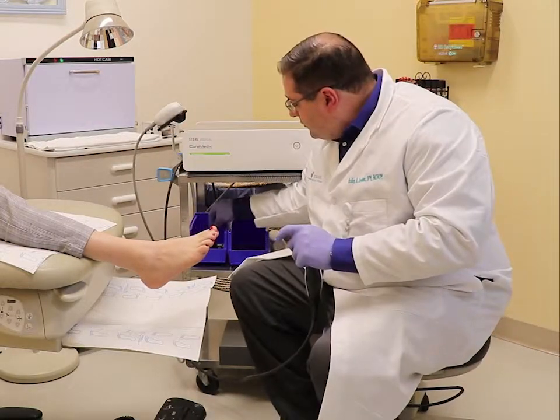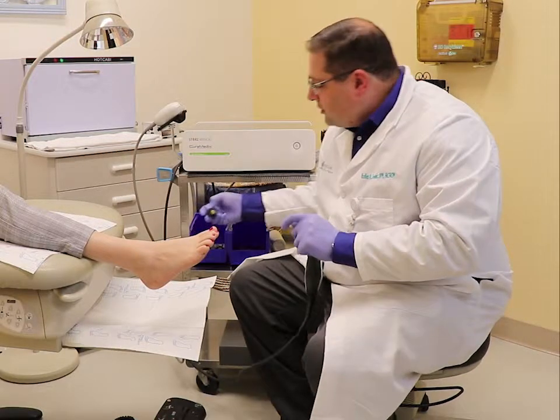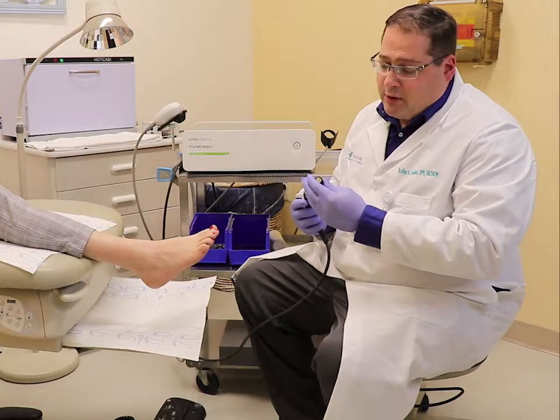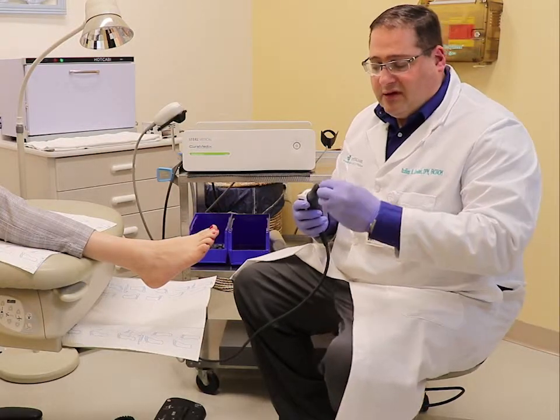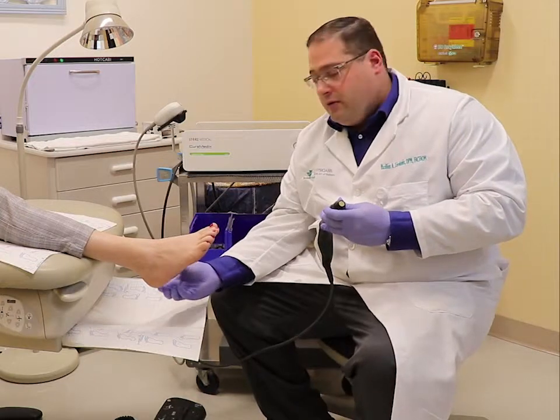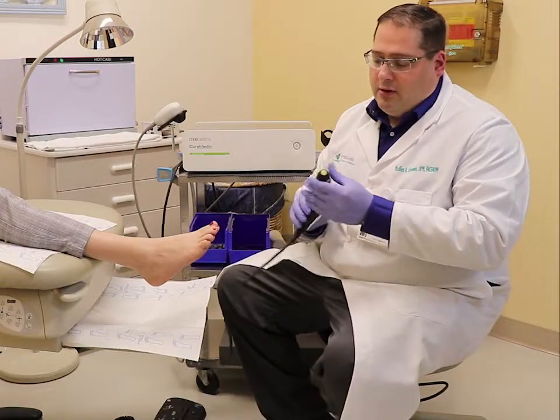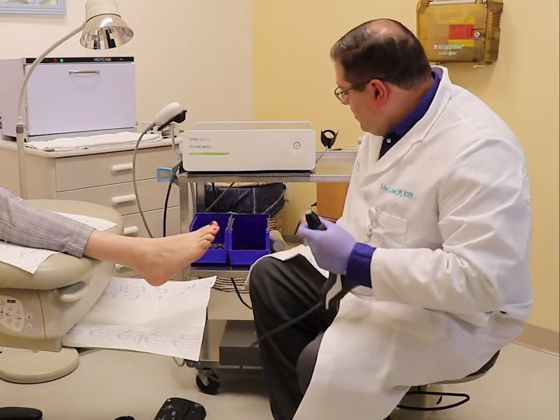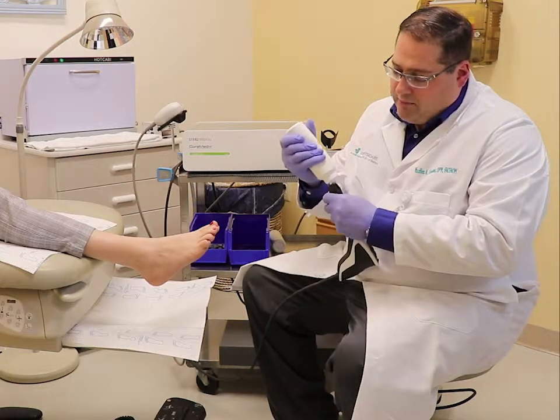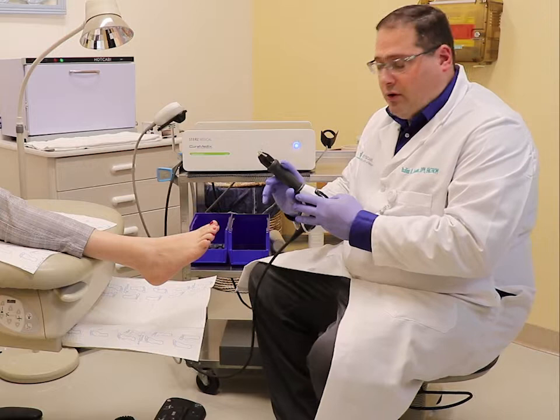The first part of the treatment involves this smaller applicator. This is narrower than the other one and is designed for deep tissue. It is focused directly on the heel where the plantar fascia originates and where most people feel their painful plantar fasciitis. We put some ultrasound gel on it — this just helps the sound waves go deeper into the heel. It's going to make a little bit of noise.